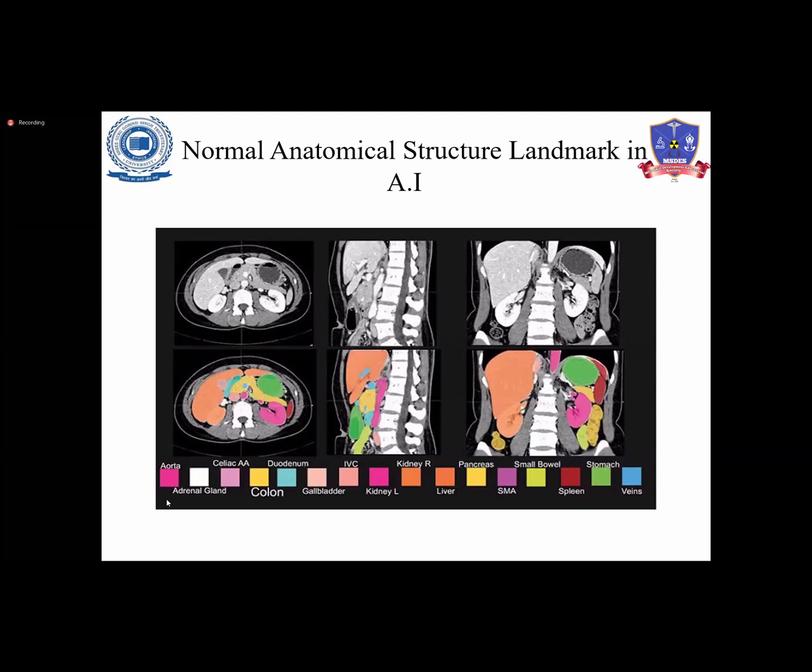That color coding is marked by us, that means by humans, because the system is not going to mark it on its own. We have to feed the data accordingly. If we mark the same color coding on two organs, like the liver and spleen with the same color, definitely we will get the same result, because we fed bad data into the system. So we have to mark everything properly, and after that, once we process the data, we get the perfect result.